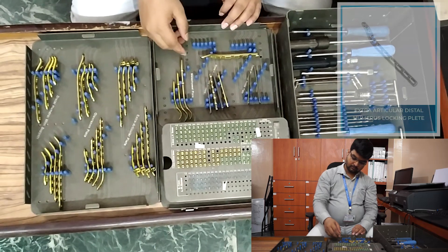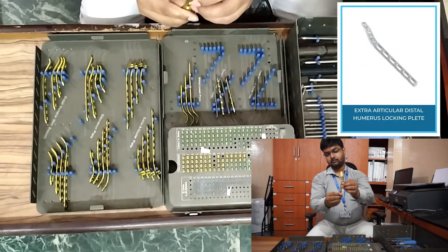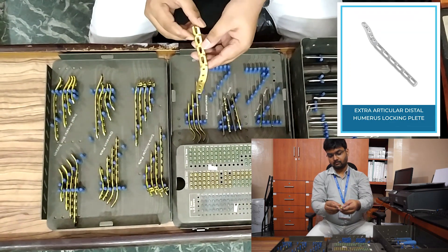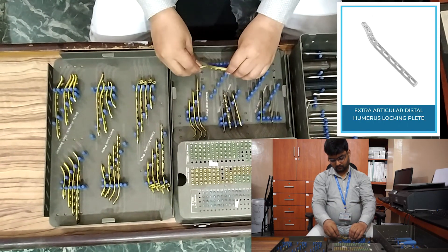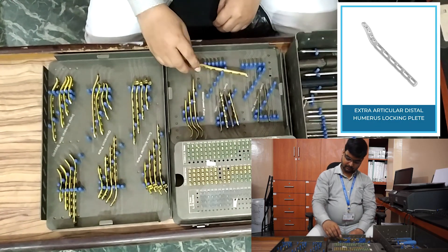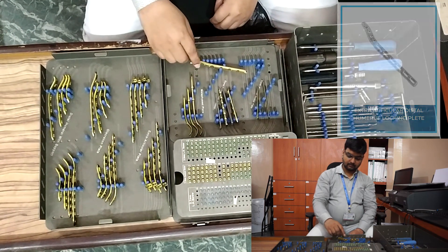Next, we come to distal humerus extra-articular plate. This comes with side-specific left side or right side. The hole configurations are four-hole, six-hole, eight-hole, ten-hole, and twelve-hole, available in both right and left.